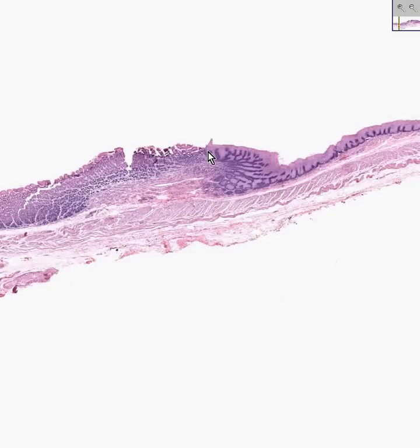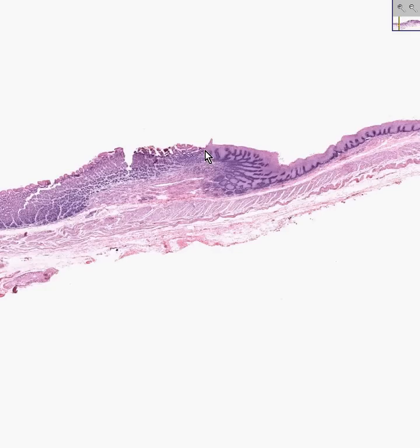Here's the precise ending of the squamous component and the precise beginning of the columnar component. This happens to be the squamo-columnar junction of the gastroesophageal area. The esophagus classically is lined by squamous and the stomach is classically lined by columnar. It's usually the cardiac portion of the stomach that is the transition from columnar to squamous.